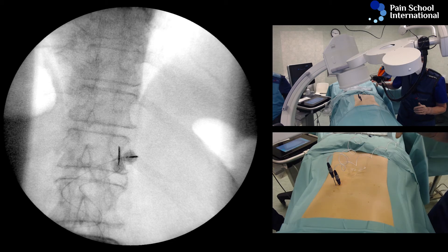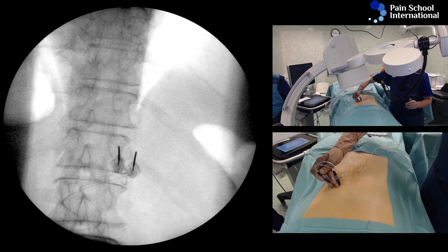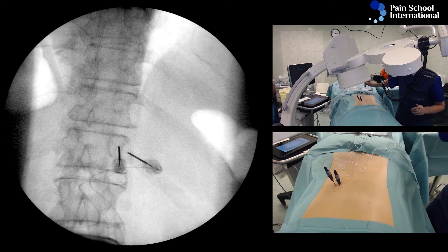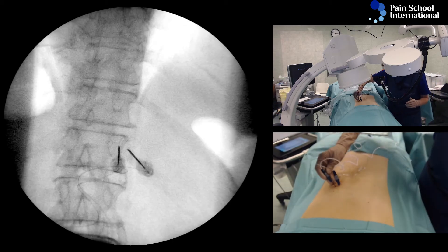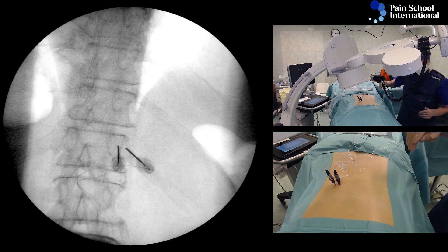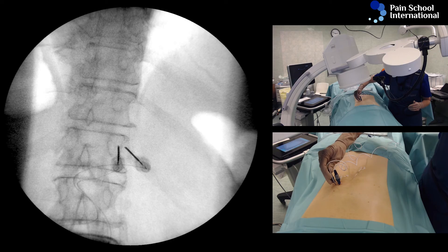The goal is to keep my needle tip behind the transverse process — that's good for safety — and I'm aiming medially. The lung is not compromised and I have to touch bone in the next few moves.